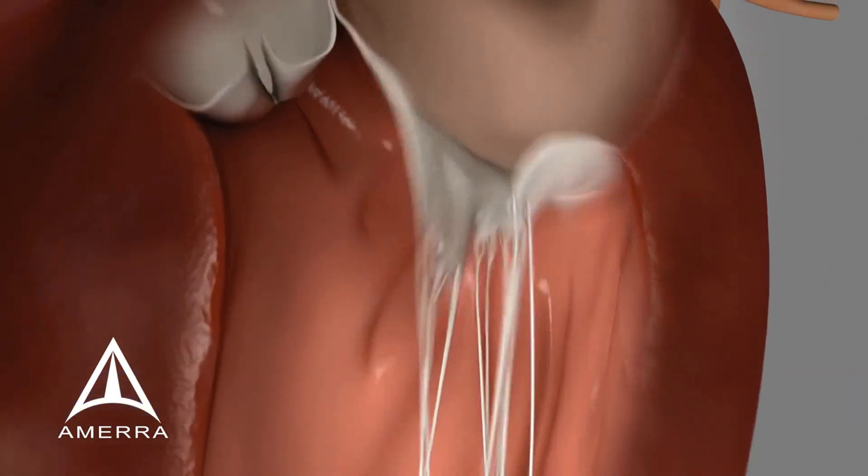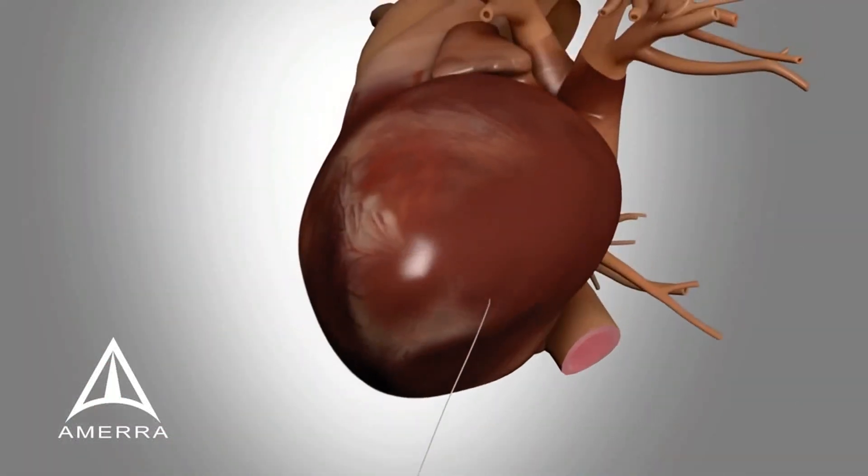Once the optimal length of the neochords has been confirmed under echo guidance, the free end of all the sutures are secured to the outside surface of the heart using a small square of Teflon felt.